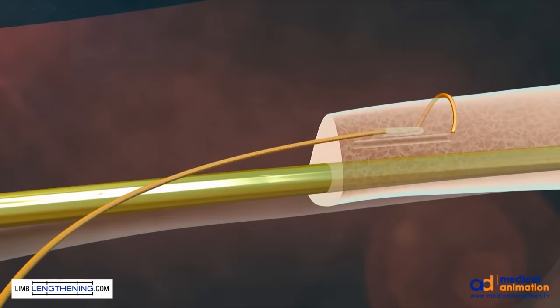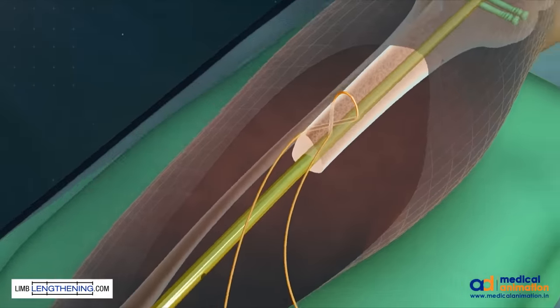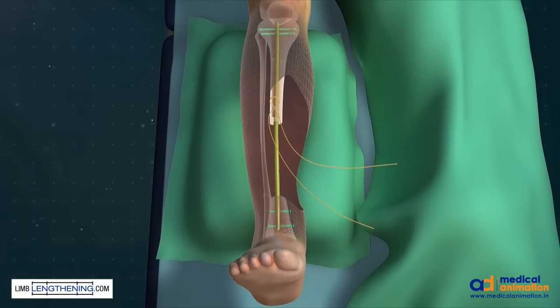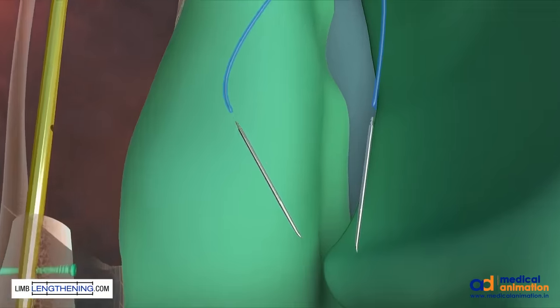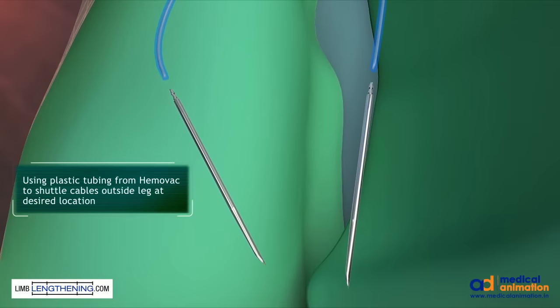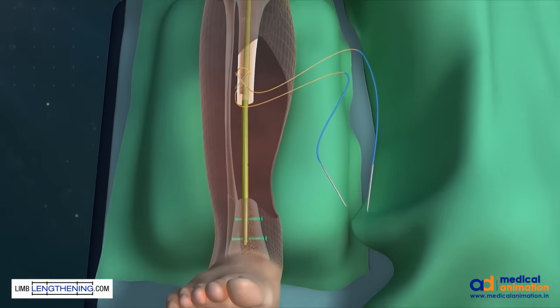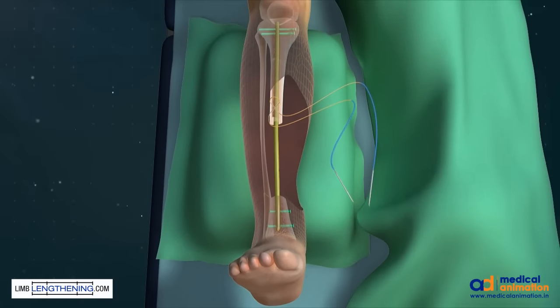The cables pass through one of the tunnels around the top of the bone and then back out. The plastic component of a hemovac is used to cannulate with the cables, and then the metal trocars with the plastic and the cable are used to percutaneously shuttle the cables outside the skin, exiting just distal to the docking site.